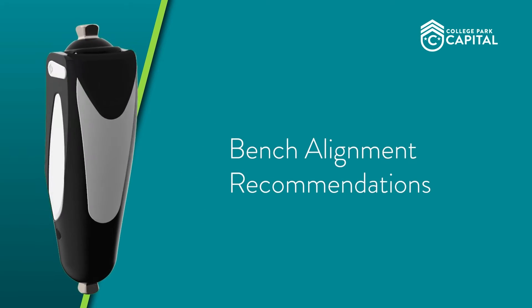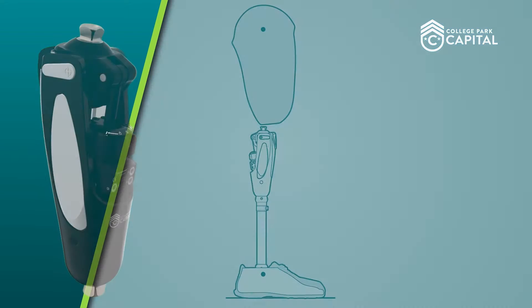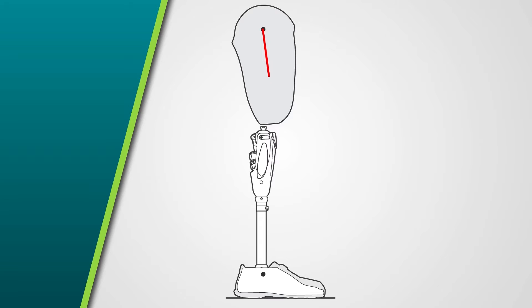The following is the recommended bench alignment as described in our technical documents. First, place the appropriate socket flexion to match the resting hanging angle of the residual femur, making sure to accommodate hip flexor tightness. A vertical line should run from the trochanter through or slightly anterior to the knee axis pivot point and through the posterior third of the prosthetic foot while in the shoe. This is an appropriate starting point for your alignment before the patient dons the prosthesis.